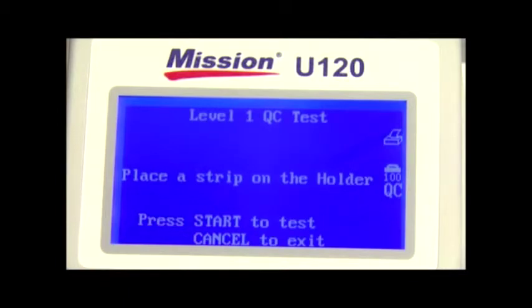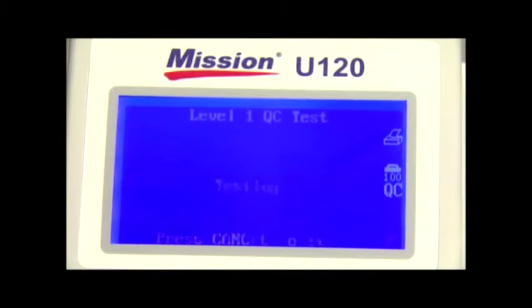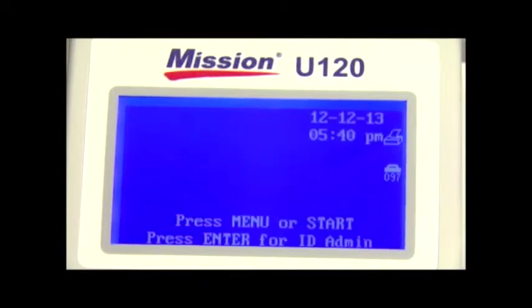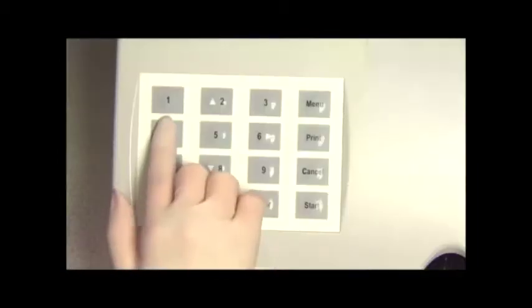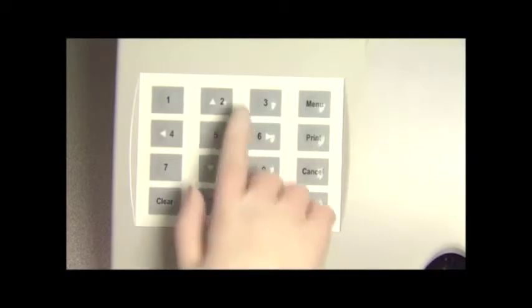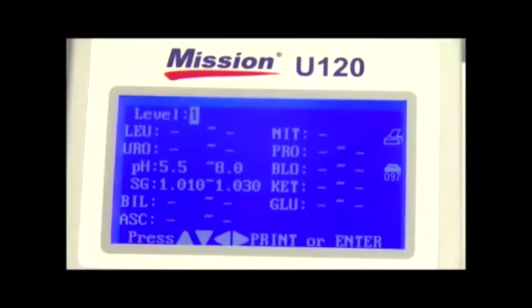When a QC test is run for the first time, QC values have not been set up. To set the QC values from the initial screen, enter the passcode 420024 to show the QC value setup screen.